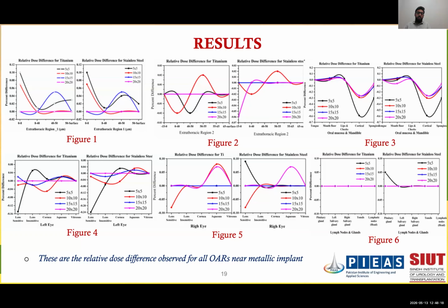So it actually gives us three ideas: that a beam of photons depends on three things. The first one is the anatomical site, the radiation field size, and the composition of the tissue. I discussed the composition of the tissue already, so now the radiation field size.